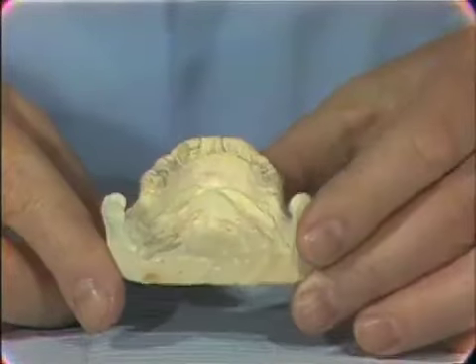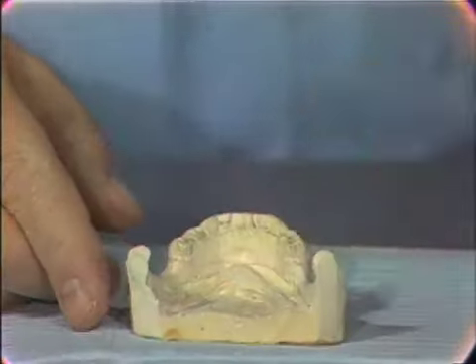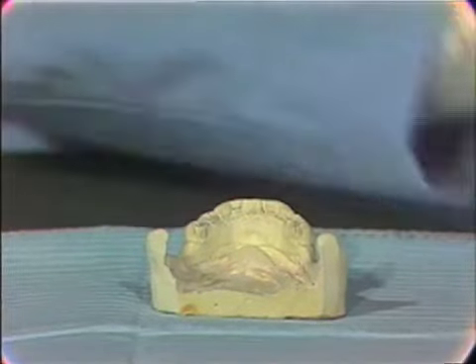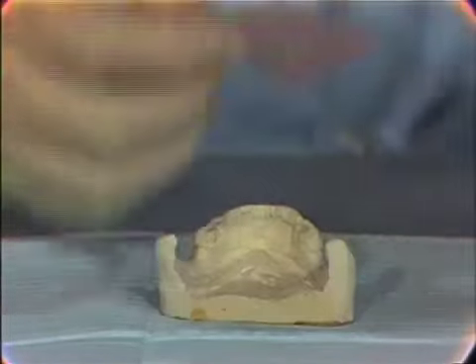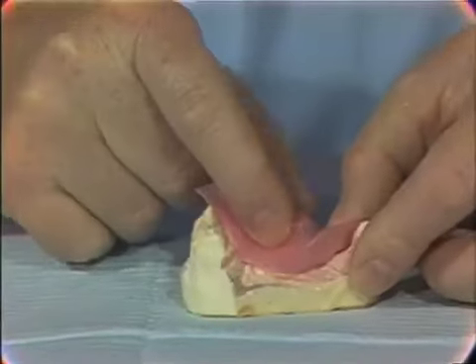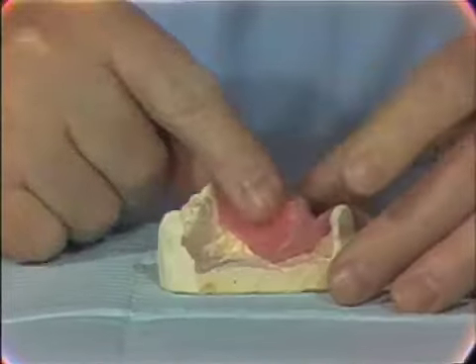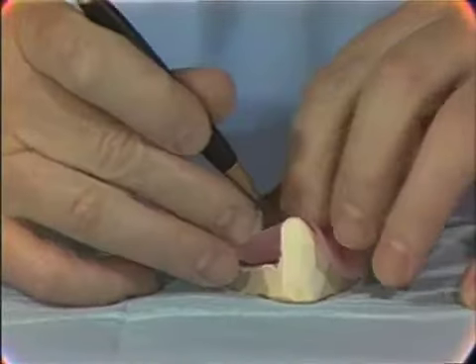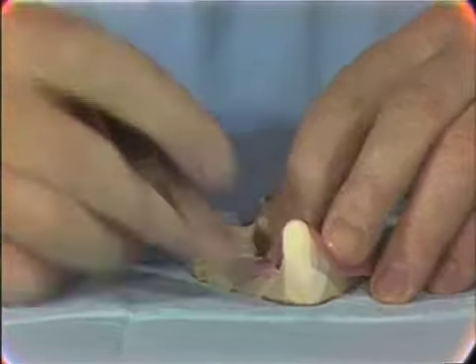What we need is a wax pattern for casting the aluminum. We can make this by adapting pink base plate wax directly to this model. We warm a piece of base plate wax and start adapting it to the outline that we penciled on the model. Now, you must recognize that this is an overextended impression, so you want to gauge the extent of your impression.